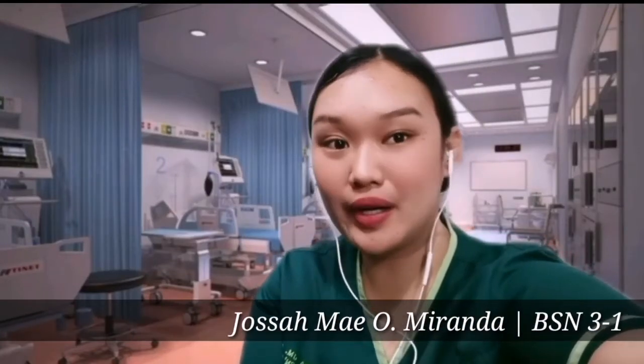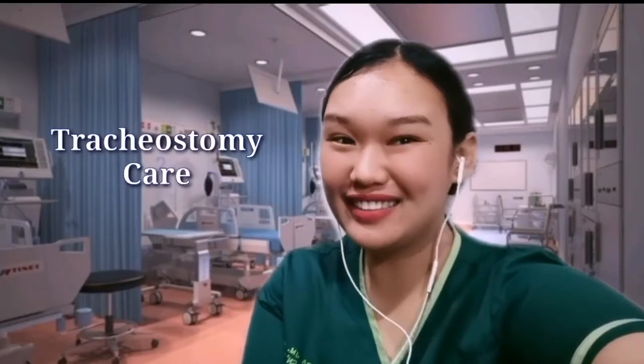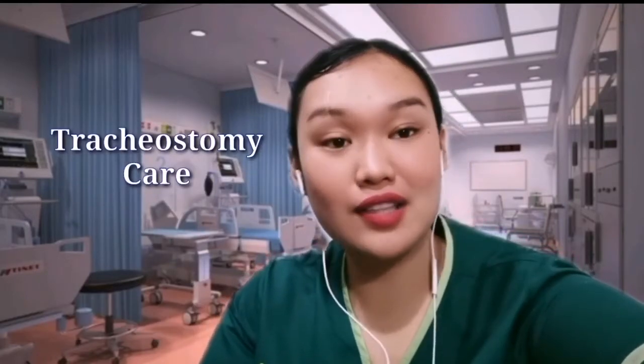So for today's video, we're going to talk about tracheostomy care. Tracheostomy care is done to keep your tracheostomy tube clean. This helps prevent a clogged tube and decreases the risk of infection. So what are the purposes of tracheostomy care?